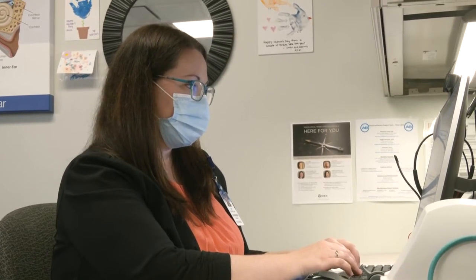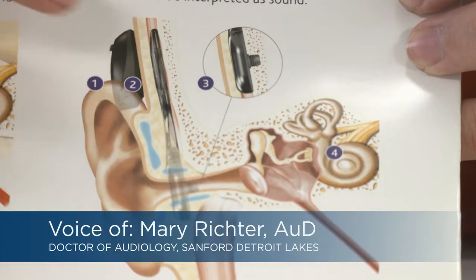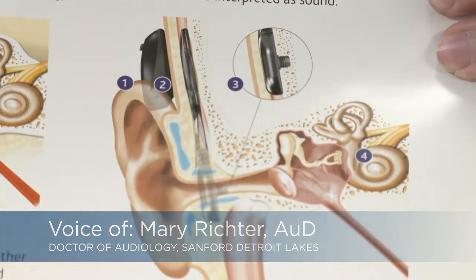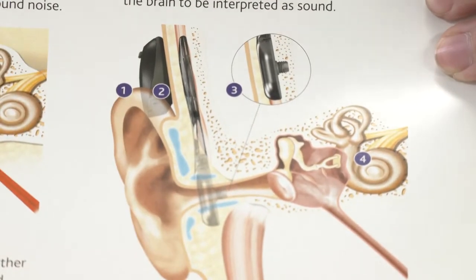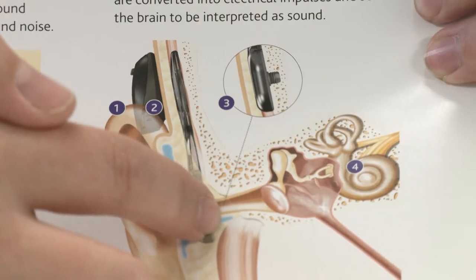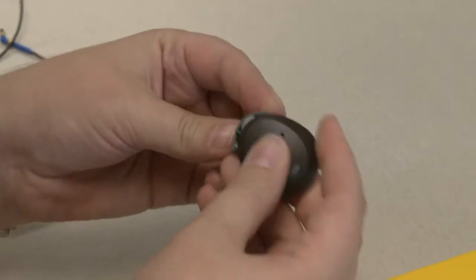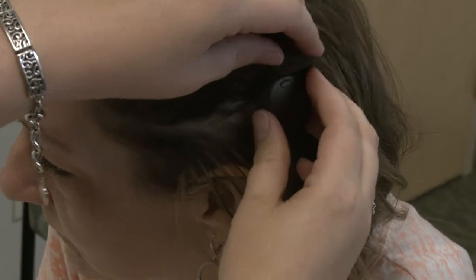So the processor that we programmed today sits on the outside of the head, but what Dr. Shinners had put in and what that's communicating to is the implant part that's underneath that. So there's a magnet right on the other side of the skin that the processor transmits that sound to. But what that actually does is vibrates the implant portion, and that's what gets that sound down into her inner ear. This receiver not only helps Duke hear better, but amazingly, it can be used with Bluetooth devices as well, allowing her to connect it to her phone or other devices.